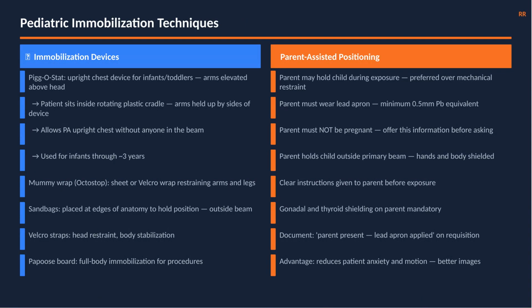Motion is the number one cause of non-diagnostic pediatric images. Short exposure time is the best motion control. Immobilization devices are the backup.